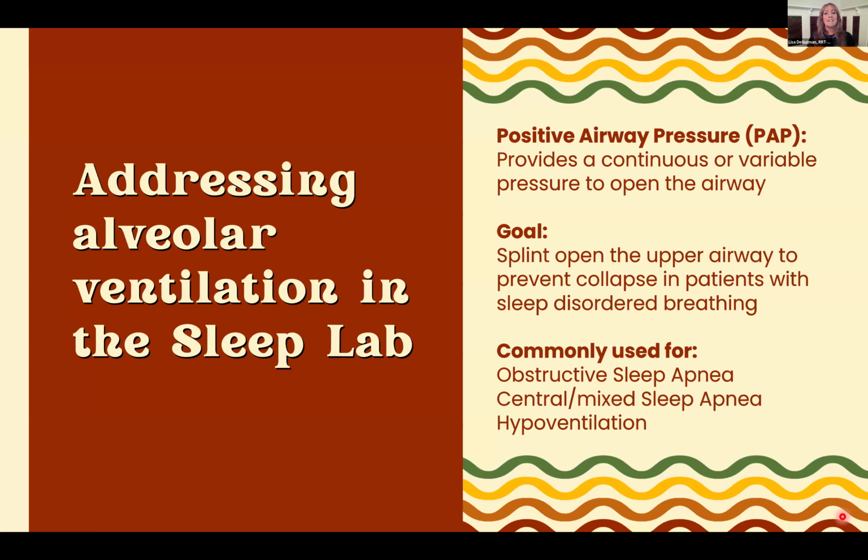So in addition to opening that airway, we're also having to watch those hemodynamic conditions, risks of, or maybe already strokes, congestive heart failure, all kinds of things going on. As the patients get sicker that come to us, since home sleep studies are filtering out those simpler cases, we're spinning a lot of those discs and trying to keep the music going, right? Commonly, we're using PAP again for obstructive sleep apnea and sleep disordered breathing, central and mixed sleep apnea, so a little more complex on the mixed apnea, and we'll look at the different modes, and patients with hypoventilation.